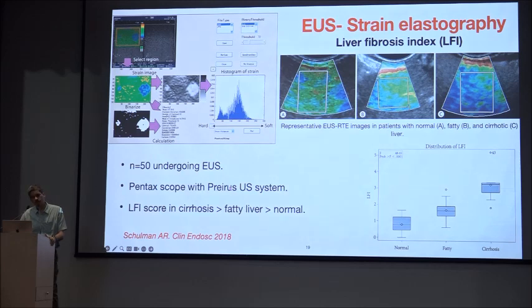Now, you must understand that since the ROI is not giving you an absolute value, as cirrhosis progresses, the fibrosis becomes more patchy. So in the ROI, the color dispersion increases. Now instead of a uniform green hue, you have a patchy color in this ROI, and this has been quantified by Hitachi software into what is called a liver fibrosis index.